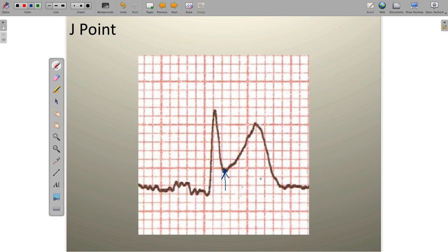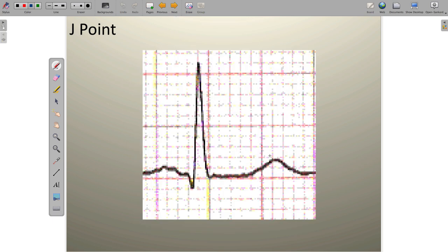There are certainly some other changes in these waveforms that we'll explore in a second. Right now we're just making sure we can all find the J point. Here's another example. The J point in this case is this acute angle that takes place at the end of the QRS complex and before the ST segment — that's the junction, the end of ventricular depolarization and the beginning of ventricular repolarization.